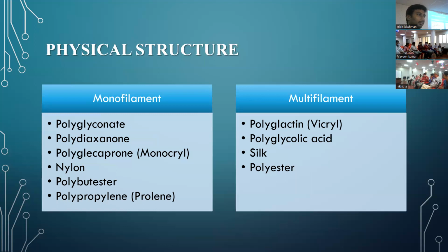Anything which is smaller in diameter, rather than making it -1, -2, -3, they made it 2 zeros, which is 2-0, 3 zeros, which is 3-0, 4-0. That doesn't mean 2-0 is bigger than 1-0. No. 0-0, then 0-0-0, 3-0. Like that you go on: the smaller the diameter, the more the number of zeros.